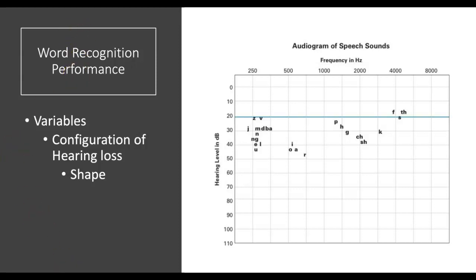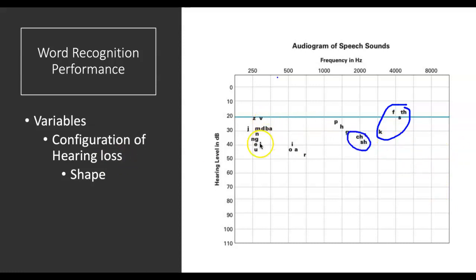But if you look here at the audiogram, like where certain speech sounds would fall on the audiogram, you can see very high frequency sounds over there, s, sh, th, right? Those fricative type sounds. Here are some affricate type sounds. Here you have the vowels here and here. So just a way to think about it is high frequencies over here, 2, 3, 4,000 hertz.